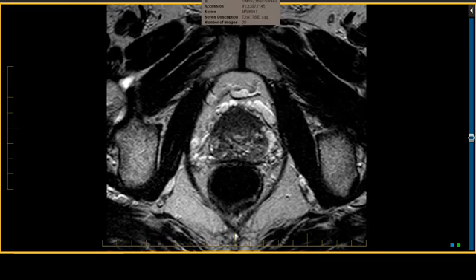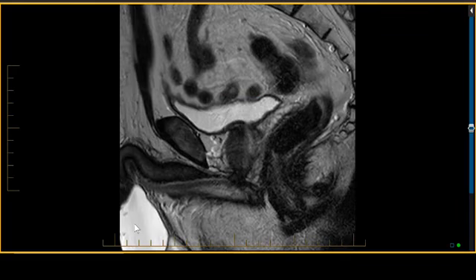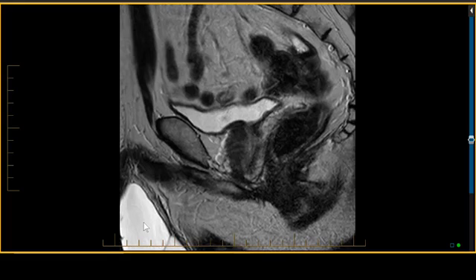And for those of you that were dialing in and watching everything, there is a huge cyst in the testicular region, an epididymal cyst, which is gigantic on the film edge. This is an example of a PI-RADS 5 in the anterior fibromuscular stromal region, both at the apex, at the middle of the gland, and the base of the gland, running all the way anterior, up and down, with suspected capsular microinvasion.